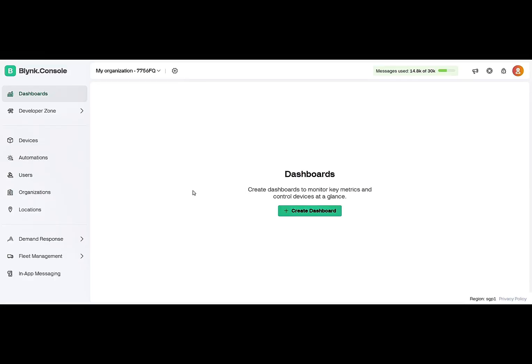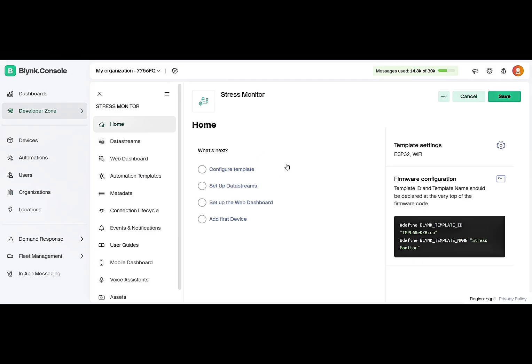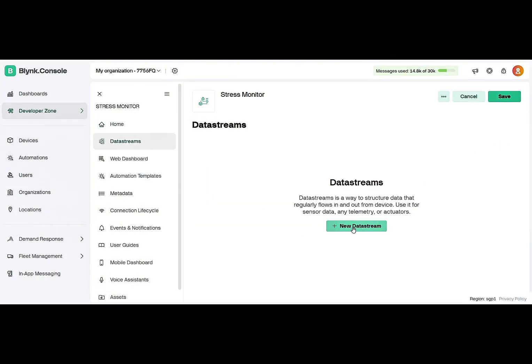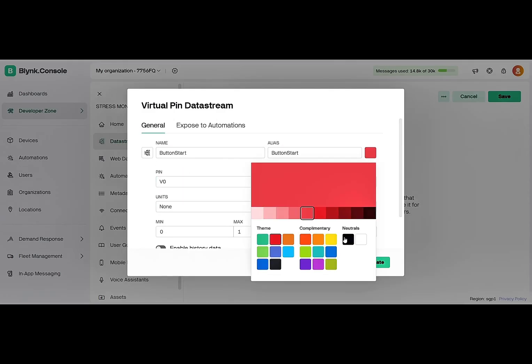Next, we will do the Blynk setup. So at first, we will create the Blynk template. I use the name stress monitor. Done. Next, we will set the data streams for our Blynk. First is the button pin. We will use the integer type.